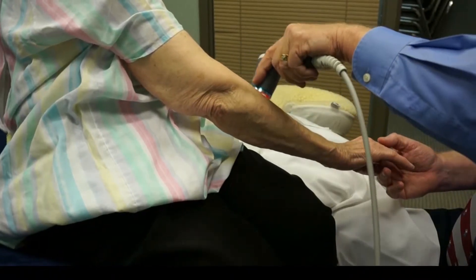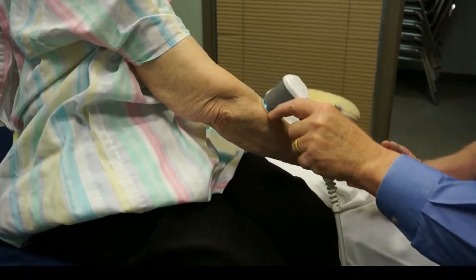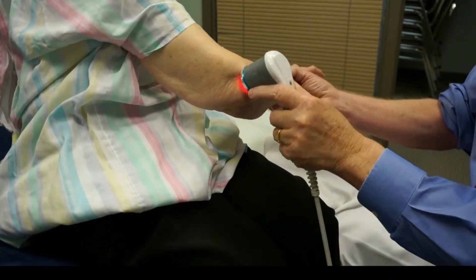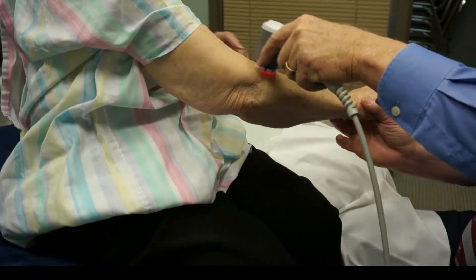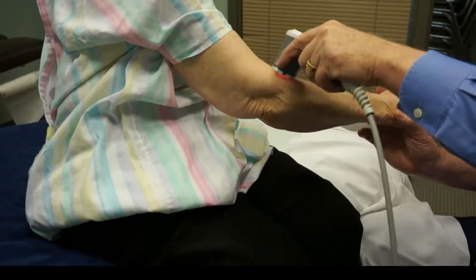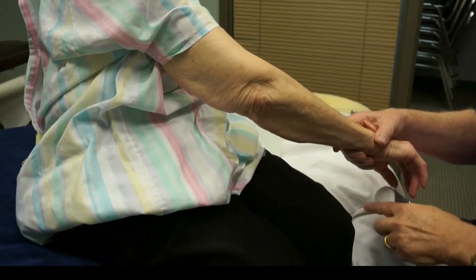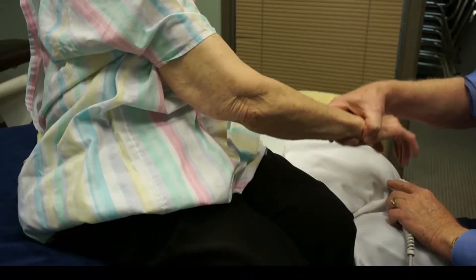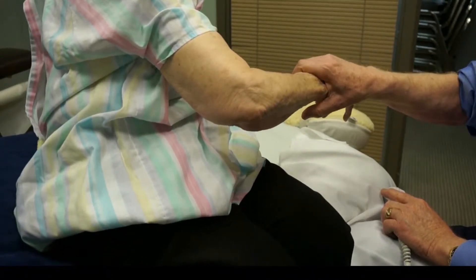Every once in a while, ask the patient to show you where they feel the pain. If we move the arm around, is there any pain? We might do something like put it down and push against me — bend your arm up, there you go, now pull your arm towards you.